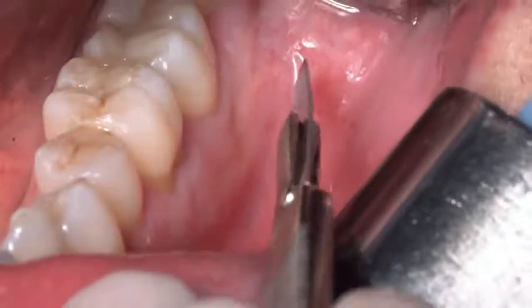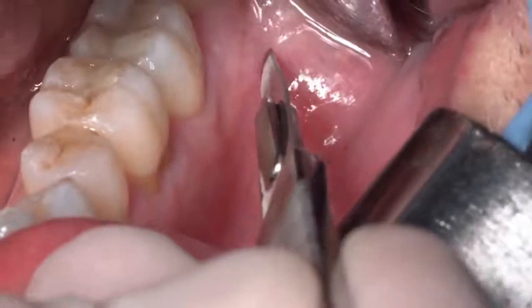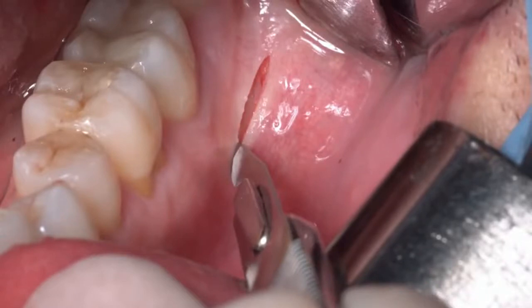Let's see the flap we use to expose the mandibular ramus. The flap is composed of two different incisions: a horizontal incision that can be made intrasulcular if we have to extract a wisdom tooth, or in the vestibular mucosa if we have to harvest some bone from the ramus. In this case we are preparing a flap to harvest some bone, so we start the horizontal incision in the vestibular mucosa.